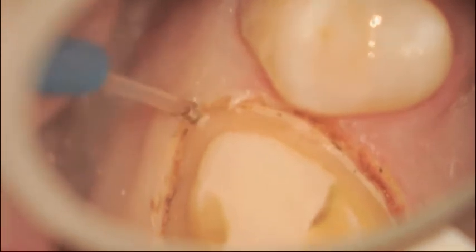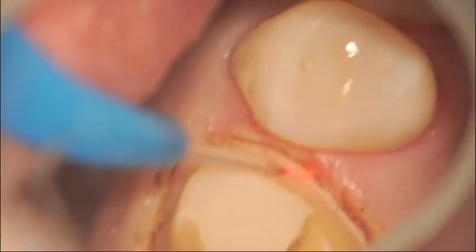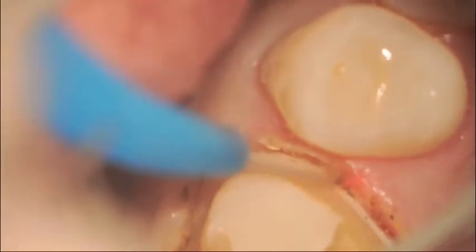At times you'll see tissue tags, which can be removed with short direct brush strokes. Eventually, either using hydrogen peroxide with an ultra-dense syringe or a wet cotton pellet to remove any tissue that has been sloughed off and is white in appearance.